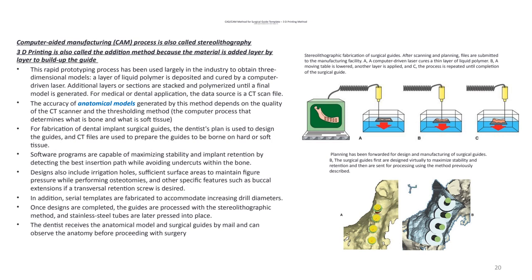Also, most of the time today, the surgical stent is done using the CAD/CAM system. What's nice about using this CAD/CAM technology is that it allows us to combine different images.